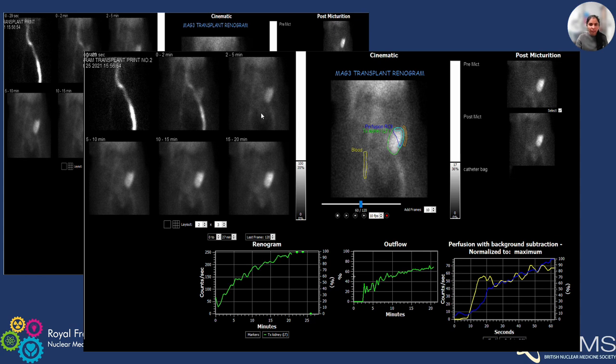So in cases like this, where you have no option of cannulating other than the leg on the same side as the transplant kidney, it is better to go for the blood ROI on the opposite side. The findings in these cases were reasonable.